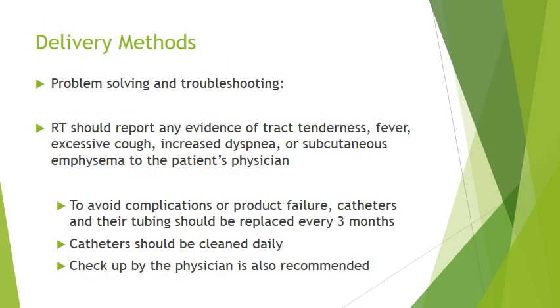So it's important for these patients with the TTOT to report any problems that they're having to the caregivers or the RT or the physician. So the RT, if you're going into the home and you're doing home care and you're inspecting the catheter, should report any evidence of tract tenderness, fever, excessive cough, increased dyspnea, or subcutaneous emphysema to the patient's physician.